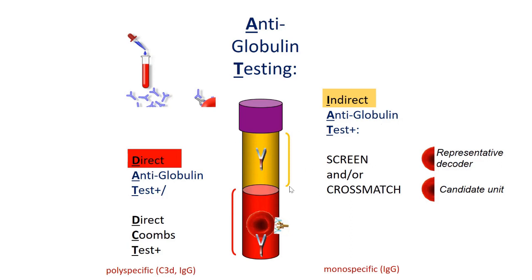These plasmas from specifically sensitized individuals can be validated in a cross-match against a candidate unit, again using the anti-human globulin to prove that the antibodies of concern are indeed not landing on a successfully selected unit that is supposed to be target negative to assure a safe transfusion.